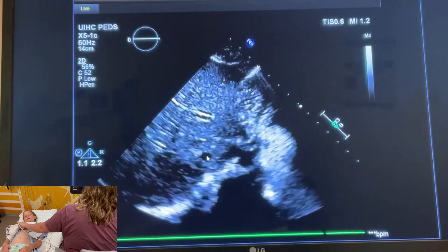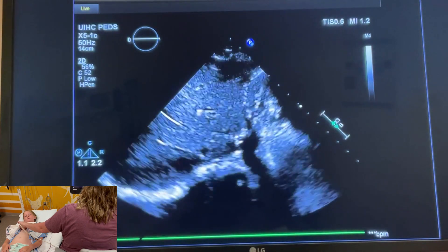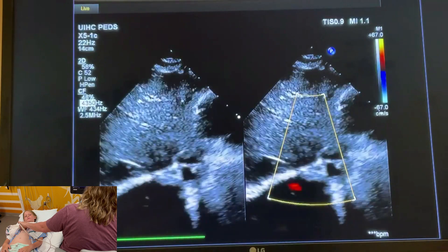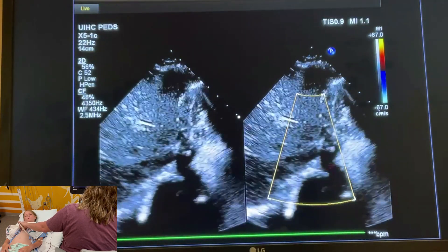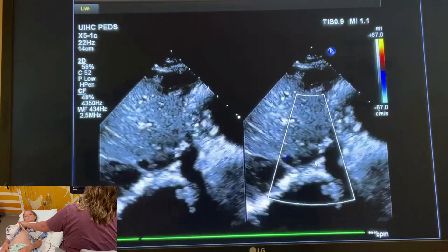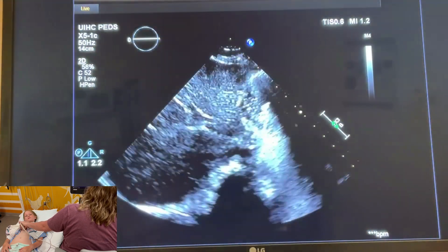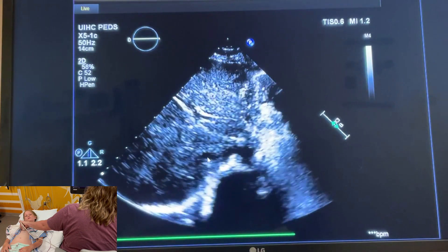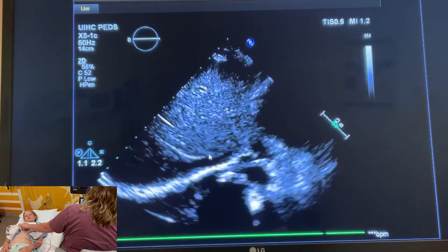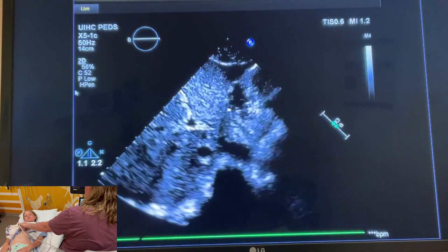The first view we would take is a situs view to show that she has normal situs. Here we're looking at the aorta — you can see pulsing red — and IVC in blue. Here we have demonstrated situs; she has normal situs. Once we take this image, we're going to follow the IVC into the right atrium. Here's the IVC and I'm going to sweep up — it's going to dump into the right atrium — and that just shows normal atrial situs. In pediatrics we often take sweeps.